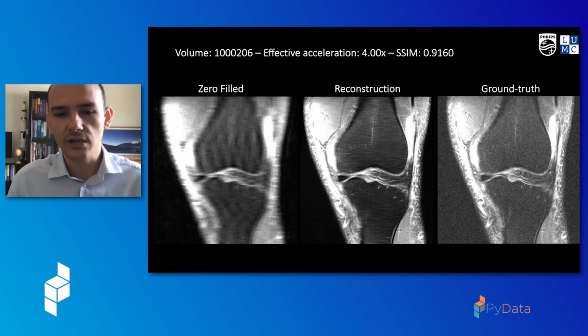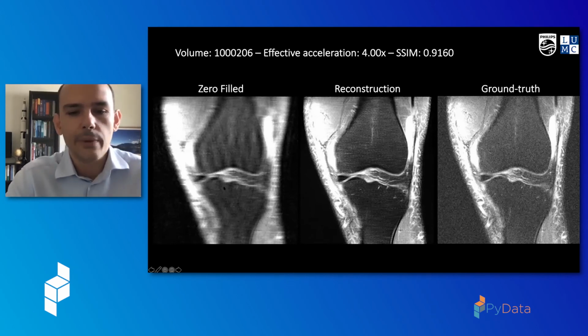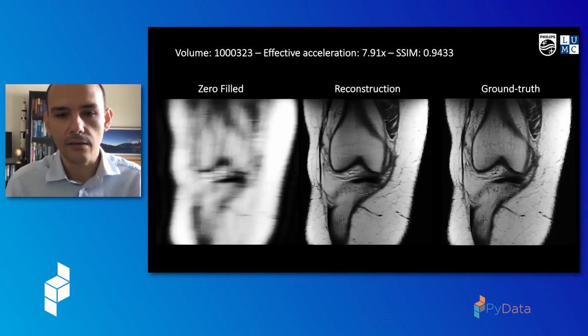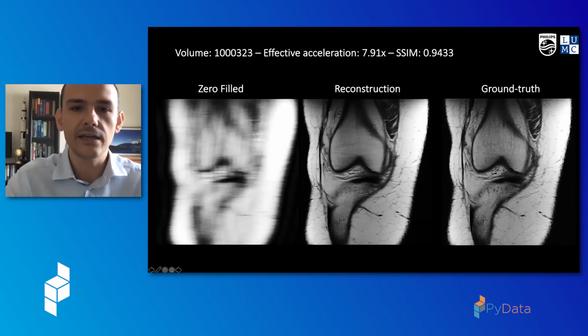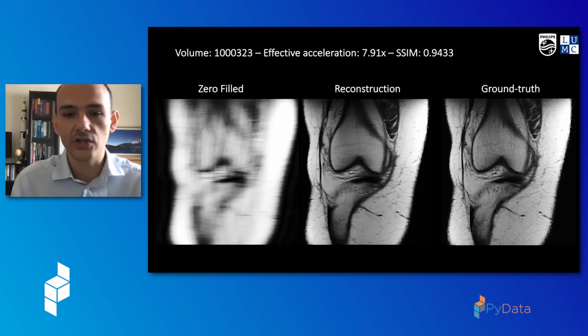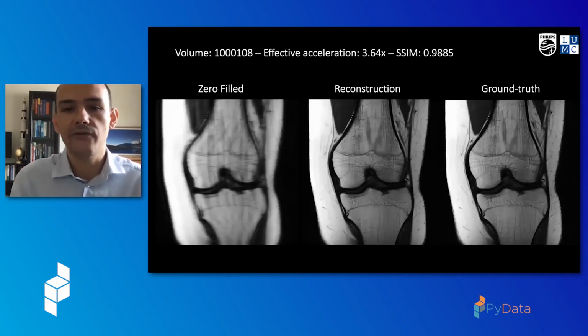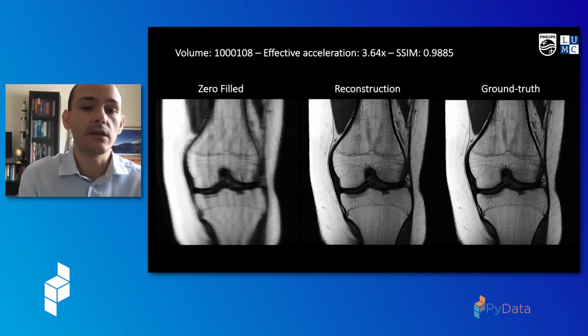Again, this one is for an acceleration of 4. Here you can see a bit better. The results are getting quite good at this point. You can see nicely defined structure at the center, and that's rather good. If we go to another acquisition that is less noisy, already with a high acceleration of 8, the recon looks quite good, and it can accelerate the reconstruction up to a factor of 8, so reducing the time that you spend in the scanner by a factor of 8. If we go to less than 4, you can hardly tell any difference between the reconstruction and the ground truth, which is pretty good, because we know that we can directly have an impact on people getting a scan.